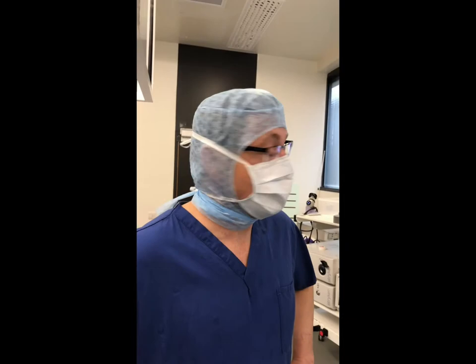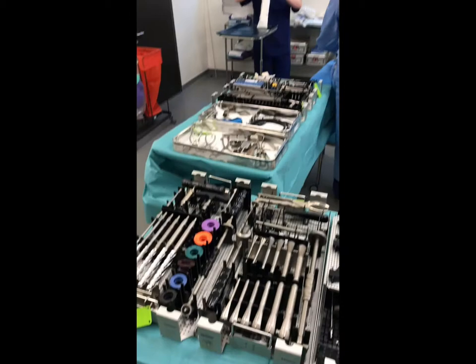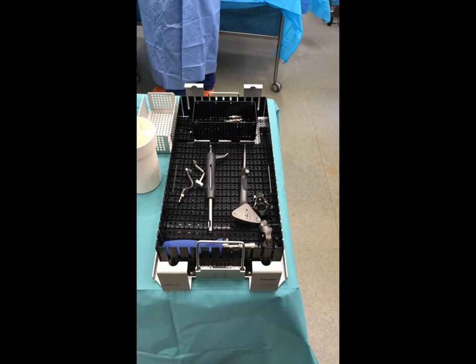Hi, my name's Gavin Jennings, and today we'll be doing a reverse shoulder replacement using the Equinox navigated shoulder system. And here you can see the patient's radiographs. The instrumentation for the procedure is exactly the same. The only extra tray for the navigation is this one.